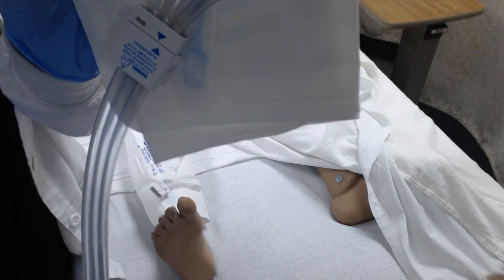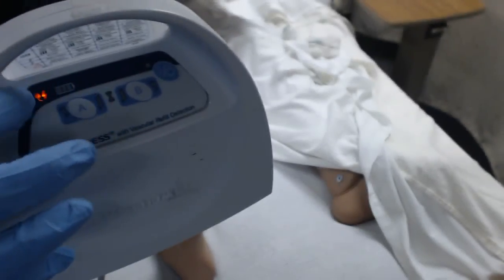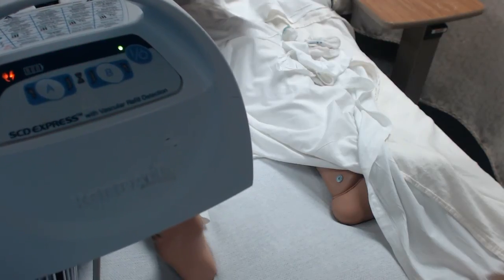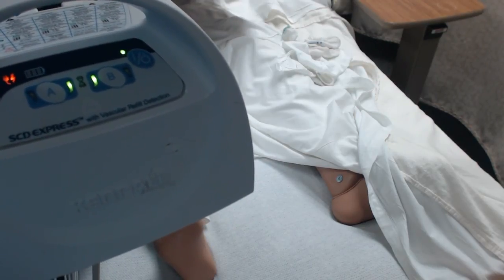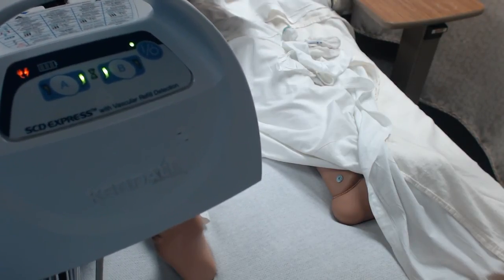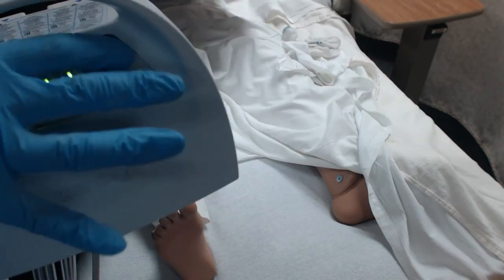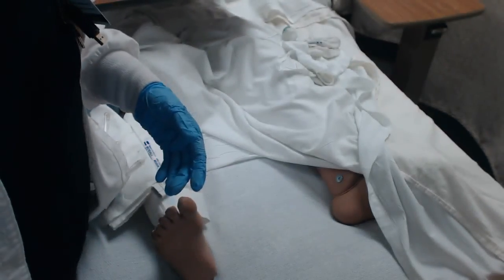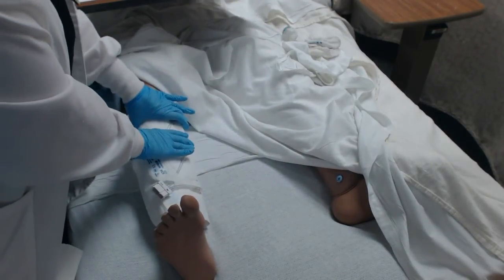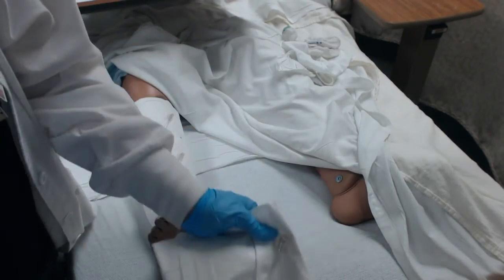Both lower extremities. You would then turn it on. There's a button right here in the corner, and that would turn it on. The device is fairly simple, although there may be times where you need to troubleshoot it. Maybe there's a leak in the tubing, but generally speaking, it's fairly simple. It would then sort of gently massage the legs one area at a time in order to promote venous return and move that blood back up to the heart so we don't have any clotting.